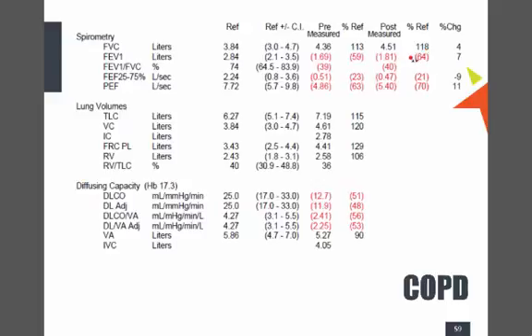And then you've got your forced expiratory volume in the first second. So we're looking at that after, it's 1.81, it's down. If I went to my chart, those of you who've got your flow chart in front of you, so this is someone with COPD, yes, they've got obstruction, the ratio's down, the FEV1 is down, it's 64%. So it's between 60 and 80%, above 60, so it's mild obstruction at this point. Interestingly, this person has actually got quite bad gas transfer, but it's mild obstruction.